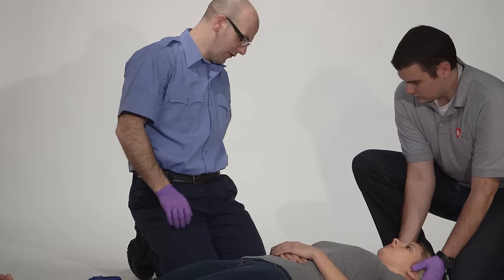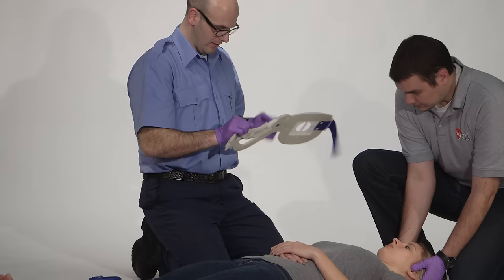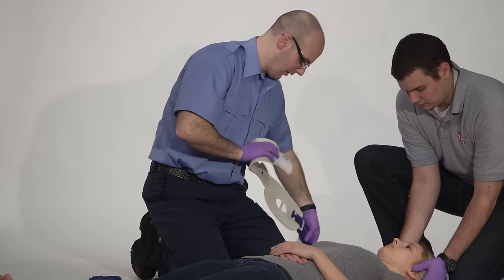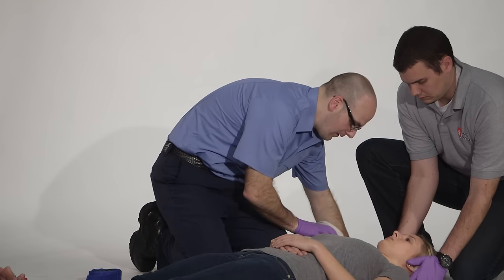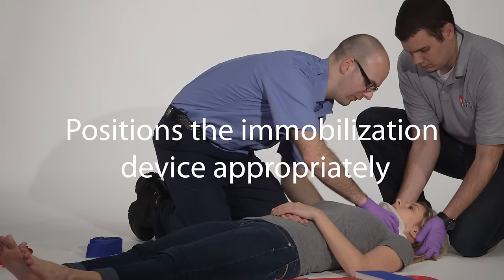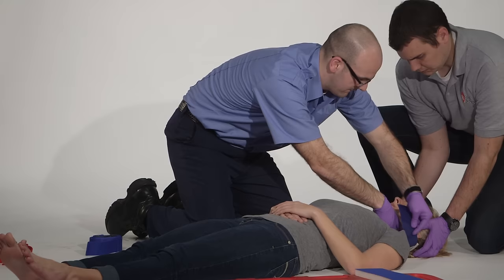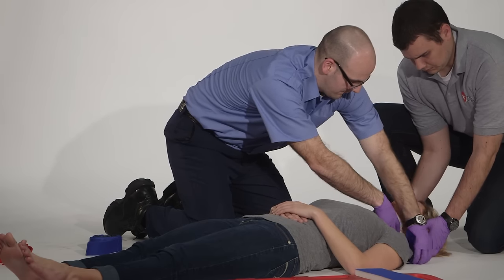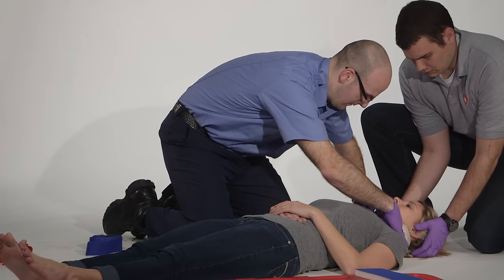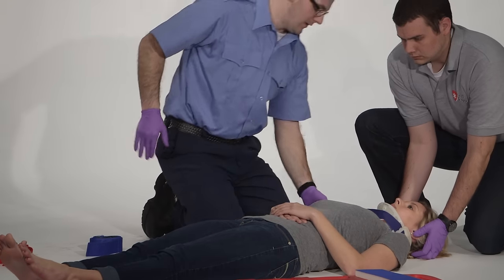The next thing we're going to do is put a C-collar on. I'll size my patient for a C-collar, select my C-collar and set it to the appropriate size, pre-form my collar a little bit, and apply the C-collar, ensuring that I'm not moving the neck around too much. Can you open your mouth a little bit for me? Perfect. Now we have the C-collar.